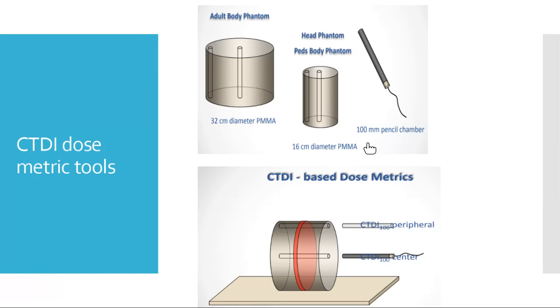Because radiation dose is different, we irradiate the patient from outside to inside because it is external. Outer layers of the patient receive the highest radiation dose. Internal parts of the patient receive less radiation dose due to ionizing radiation attenuation. For that, we need to find a kind of weight to have an average radiation dose.